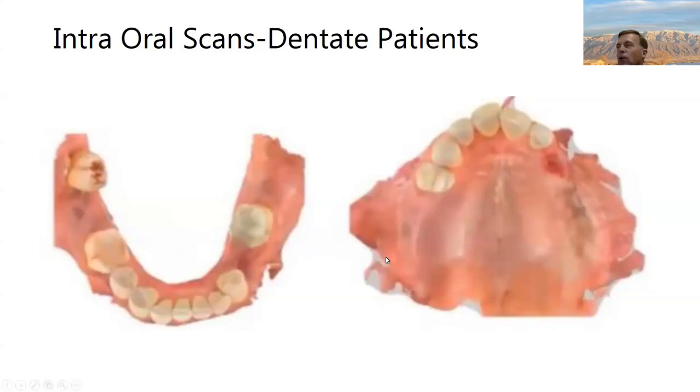We're going to be stacking a lot of files on these to build your digital patient. And if we don't have a complete scan, then there's a certain amount of luck involved if you capture common areas between the various scans. If you start with a very large scan, it makes the file alignment process much more reliable later.